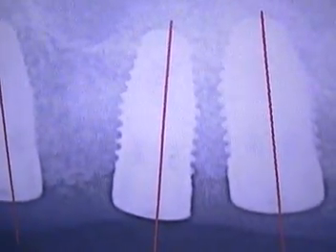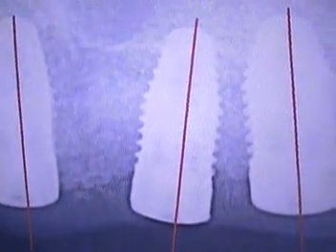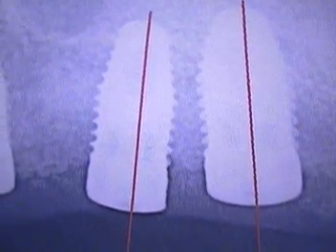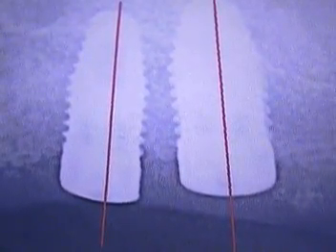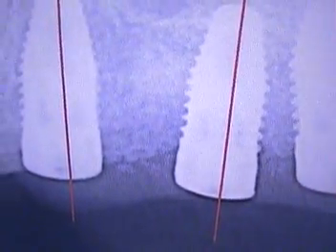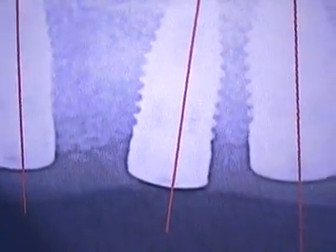I'm going to show you a Nobel case today — Nobel Select. We've shown you a lot of Straumann cases, a lot of bone level. This is their implants that are completely submerged in bone but have no polished collars, so they end at the crest of the bone and then stick up just a little bit. There are some flared healing abutments located on these. I ran this by the Nobel experts — he felt there were any present. But I want to show you how the system looks and varies from the Straumann system just a little bit.